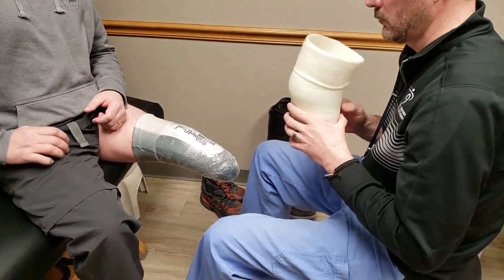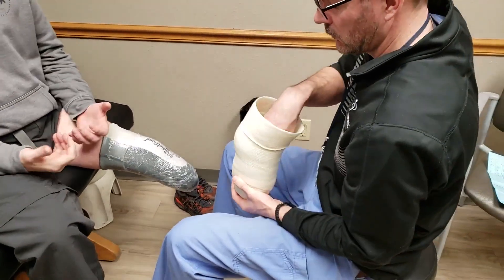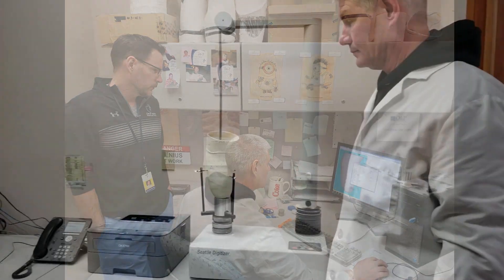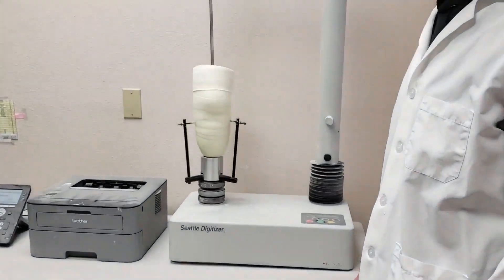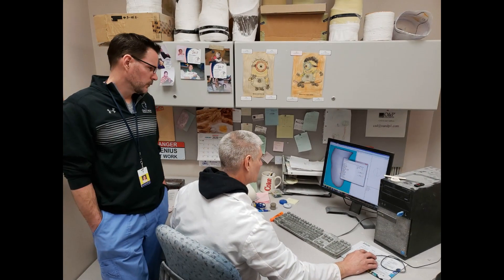Once the negative mold is approved and worthy of moving forward, we visit the CAD-CAM aspect of our production process to digitize the inside of the socket, which creates a computer-generated 3D image that our software can manipulate and further shape to the prosthetist's guidance.